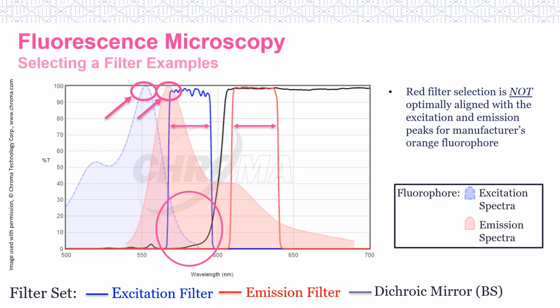Please note that although the OGT's CytoCell catalogue FISH probes are manufactured with a Texas red fluorophore, some of our custom MyProbes options may contain orange. Be sure to always check the product specifications of each probe before use, regardless of vendor, to ensure the optimal signal intensity.